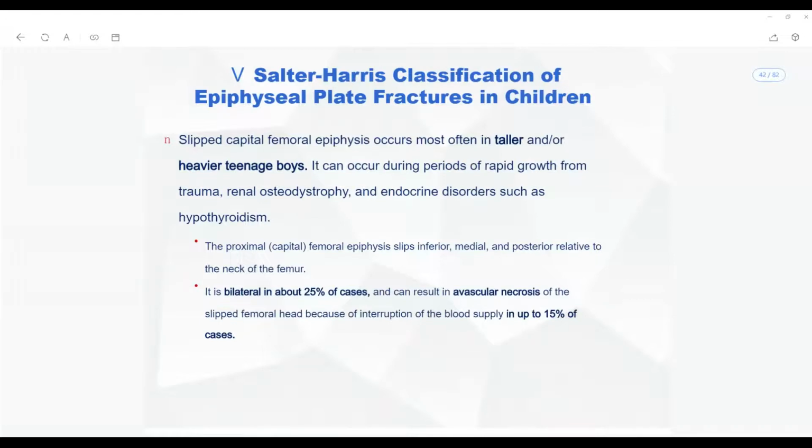So when you are suspecting that it is related to endocrine problems, and it shows up on the femoral head, you are going to confirm endocrine problems related to thyroid or hypothyroid conditions, also on the carpal bones, right? Last time we came to understand that the ossification centers appear at different times. But by the age of 10 years and beyond, all the bones should have formed, right?